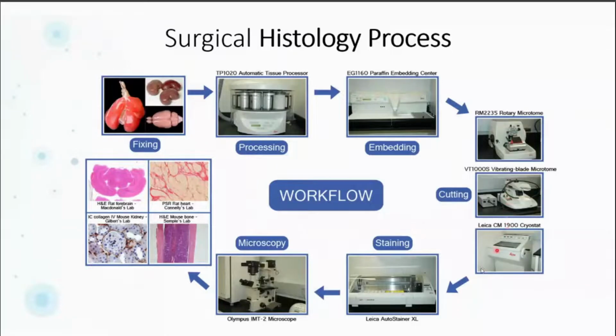And then it's put onto a slide, and typically some type of stain. H&E is the most common for initial staining, and then there are a lot of immunohistochemical stains that are added to highlight individual biomarkers that present themselves in the tissue.